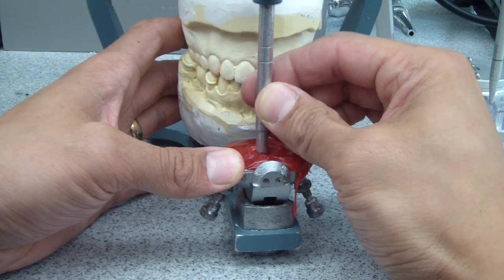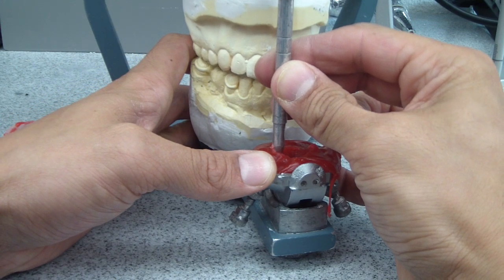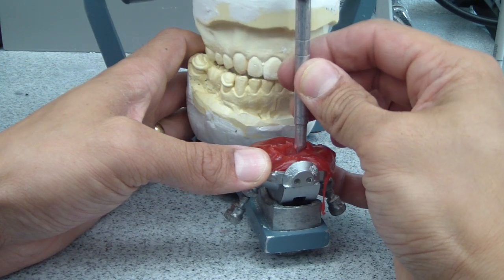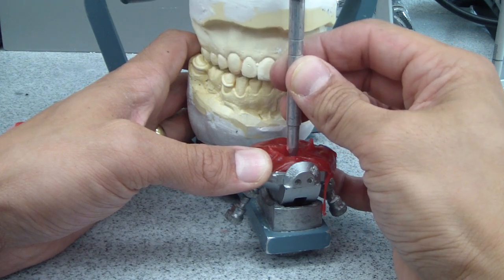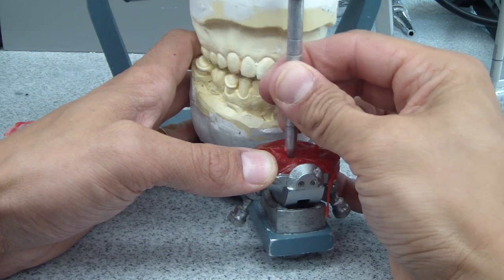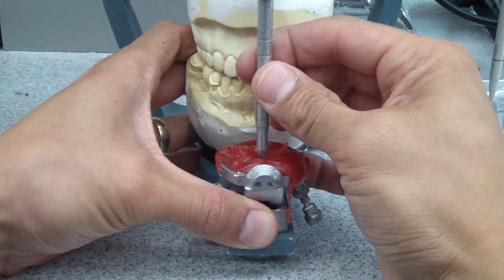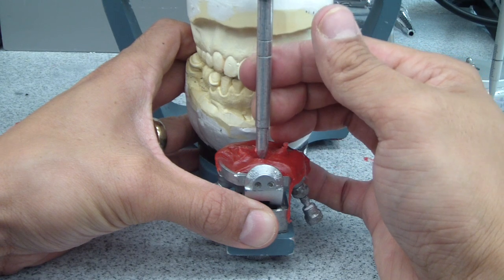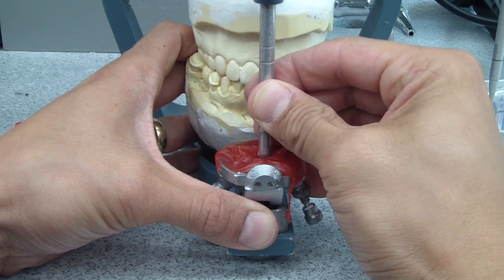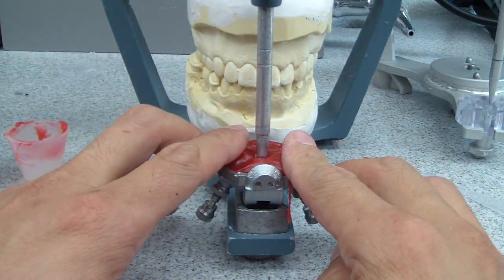Alright, almost set — it goes really fast. Open all the way. It's a very simple thing. And we have our chicken foot right there. You can see how it's just slightly binding here; if it's set right, that's not a problem. We can just trim that back with a knife. Essentially that's set.